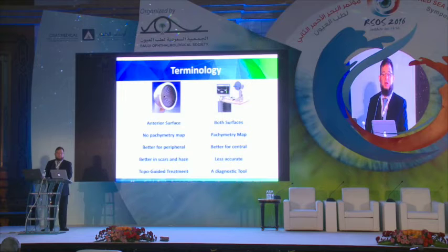For this reason, topography is a must when we want to go for topo-guided treatment, while the Scheimpflug-based can be used as a diagnostic tool. So topography is a must when we want to go for topo-guided treatment.